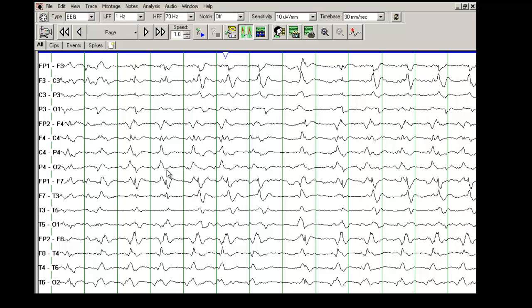These discharges are occurring periodically, but these do not build up into an electrographic seizure. So what would constitute an electrographic seizure? Number one, if there was a change in amplitude, a change in frequency over a period of time.